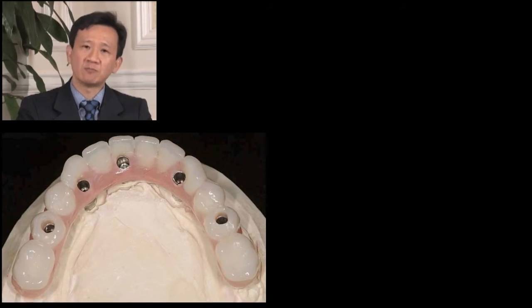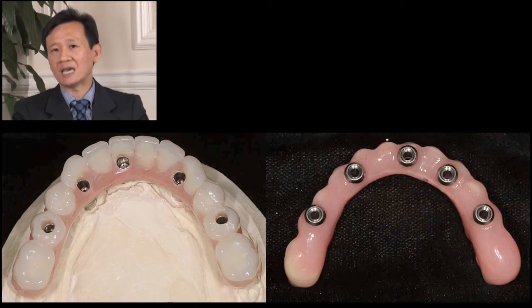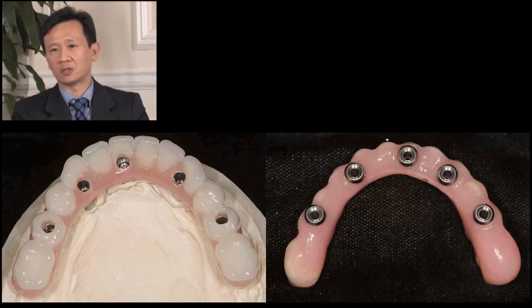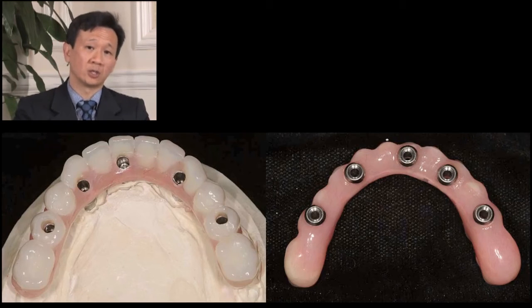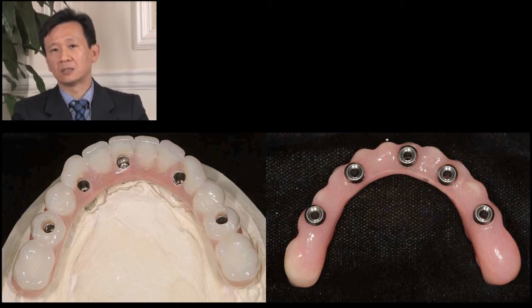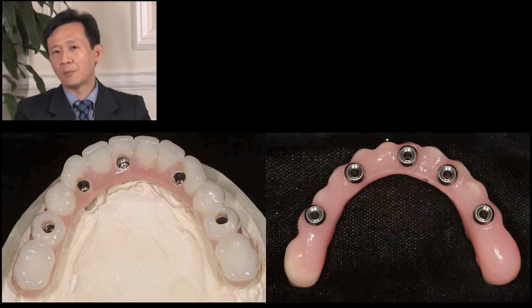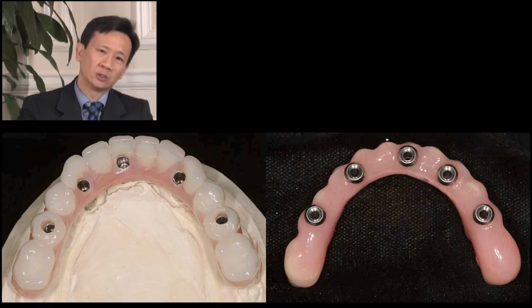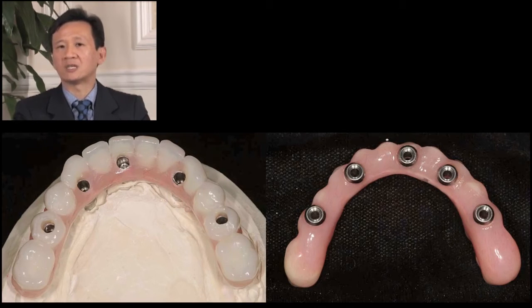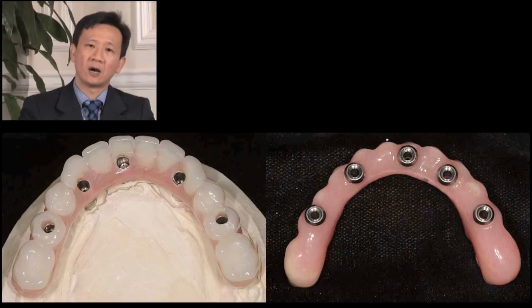And the other change is making the prosthesis direct to the implant without using any of the guided abutments or the adjustable abutments. The main controversy of the adjustable abutments, or the purpose of the adjustable abutments, was to allow for a change in the z-axis to compensate for passivity of fit. But my suggestion, or my conclusion, is that passivity of fit does not necessarily take place with immediate loading of implants, as well in comparison to osseointegrated implants.